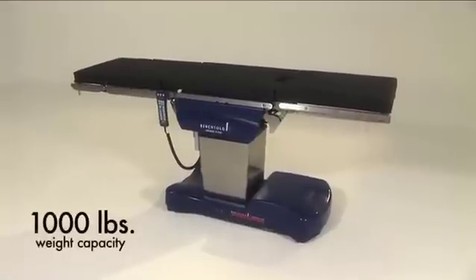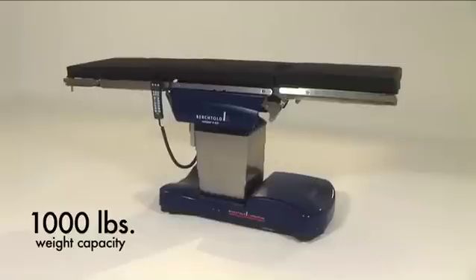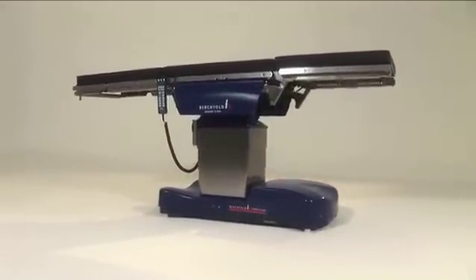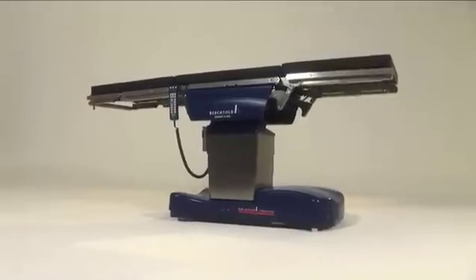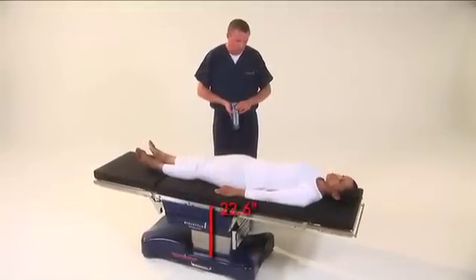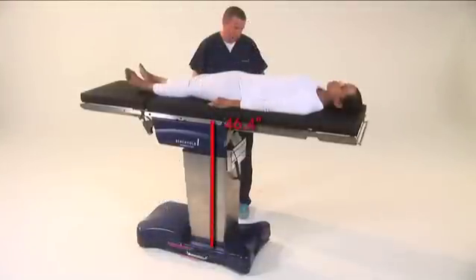With a weight capacity of 1,000 pounds of lift and articulation throughout the entire range of motion, the D850 is the table of choice for bariatric surgical procedures and includes a vertical range of 22.6 inches to 46.4 inches.